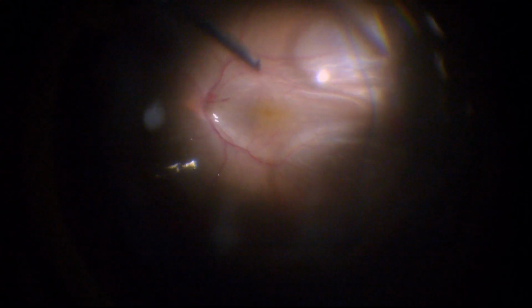And as we can now see, there is a PFCL bubble overlying the posterior pole of the retina, which has right now made the retina flat, which otherwise was detached. And on touching this particular round object, it moved just like any solid object would, which would slide and glide in this subretinal space. So I decided that this must be a crystalline lens, and I could also see that there was an associated retinal break just temporal to it.